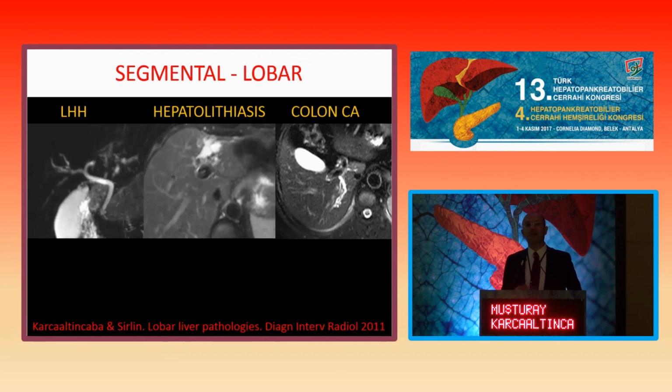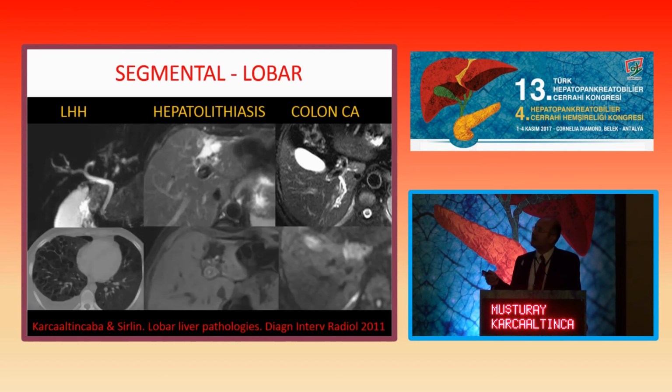Okay, so what should we think in the patients with proximal, mid, or distal strictures within the biliary system? This part, usually you don't see much in your clinical practice because these are oncology patients most of the time. These are chronic patients, and this is a pathology involving the lungs and the liver. It's known as Langerhans cell histiocytosis. So the lung findings are typical, so if you see it and a biliary stricture associated with that, you can easily understand what's going on within this patient.